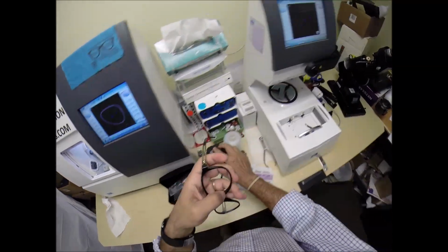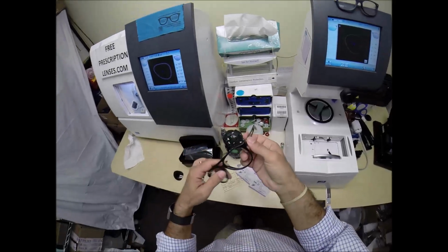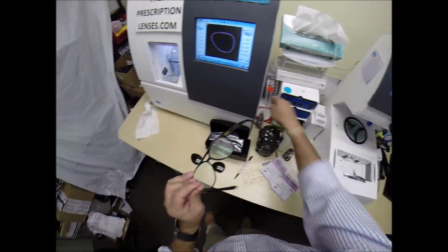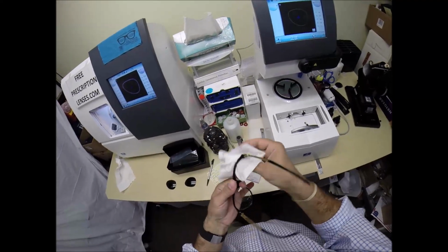Now again, if these were prescription, I would check the prescription in here. Then take my PD stick out, measure the pupillary distance, and everything is perfect. I don't have to do that. The one thing I do want to do is clean it up. And of course, this is the portion in every video that as I clean your lenses, I explain that when you get these in the mail, there is a small chance that these could fit too loose or too tight.